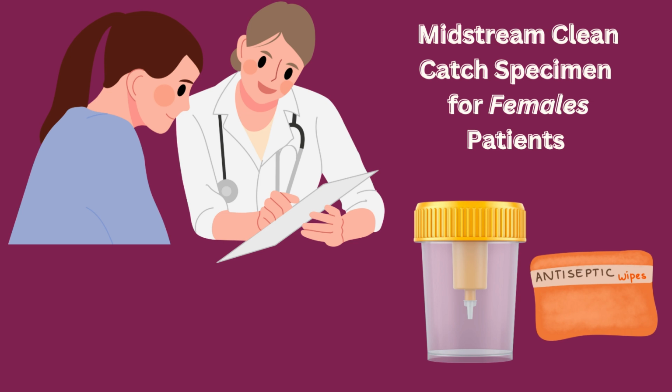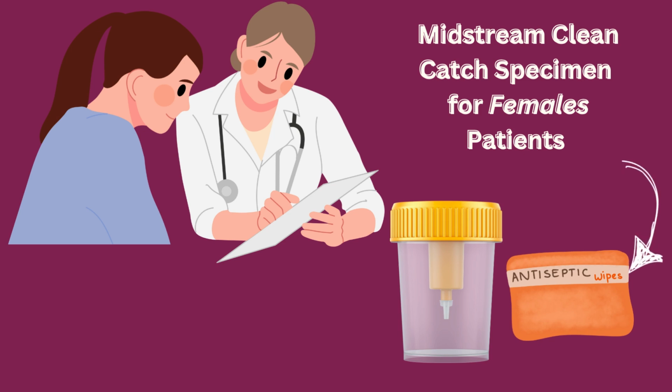Next, I will instruct the patient how to collect a midstream clean catch urine specimen. This specimen is recommended for identification of the presence of UTI. In order to instruct the patient, we would provide them the equipment, which is the sterile container for the urine specimen, and 3 wipes because it will be a female. If it was a male patient, it would be 1 antiseptic wipe.